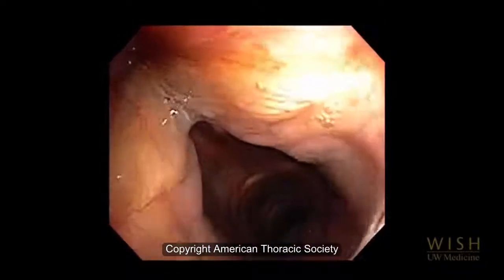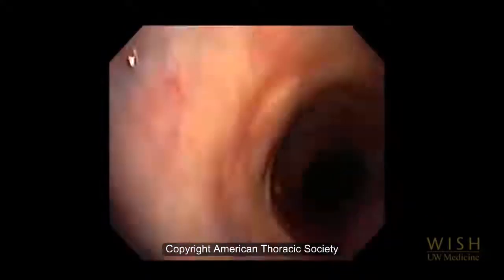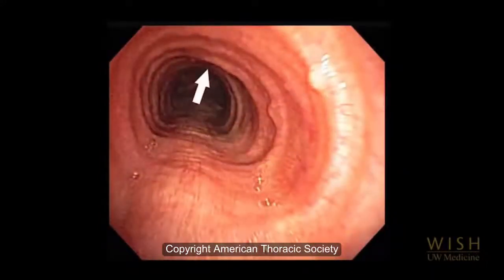Try to keep the tip of the bronchoscope, and therefore the image, in the center of the airway at all times to avoid causing trauma. Orientation within the trachea can be determined by the characteristics of the tracheal walls. The anterior wall has cartilaginous rings which maintain its curved shape. The posterior wall is membranous with longitudinal striations and collapses with coughing.